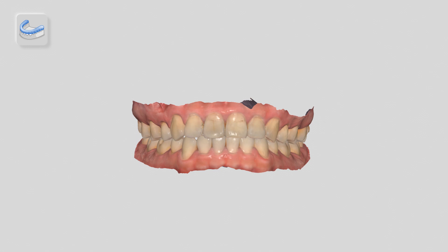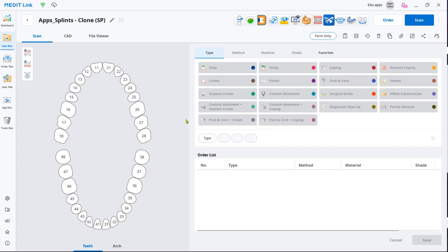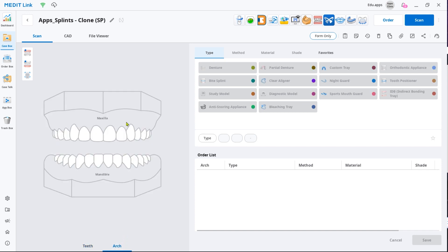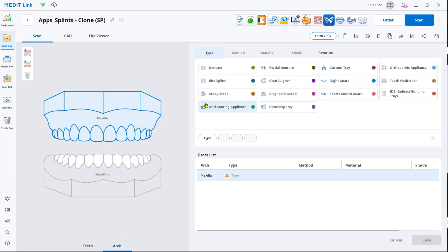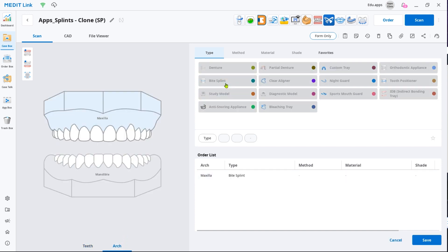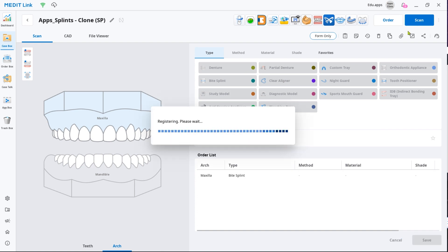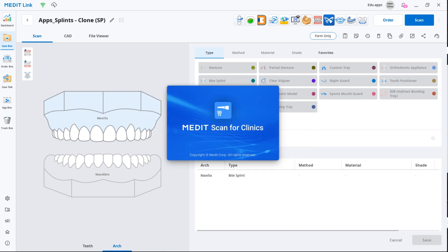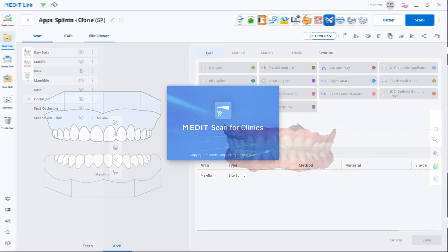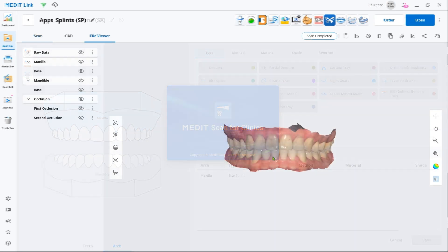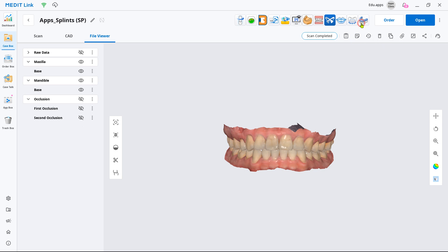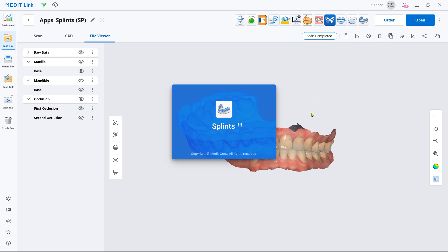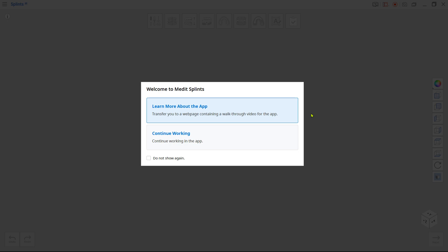To create the splint you'll first need the scan data. Create a new case, select the arch tab at the bottom and choose bite splint as the product type. Then click scan and capture data for both maxilla and mandible. Once you have the data, run Medit splints from the top of the case detail window.